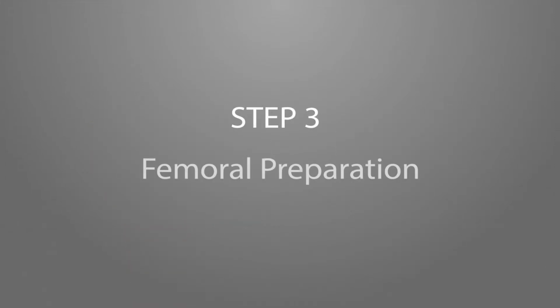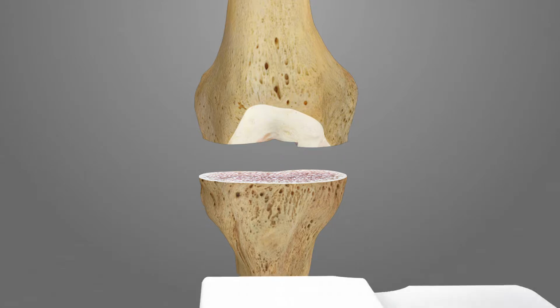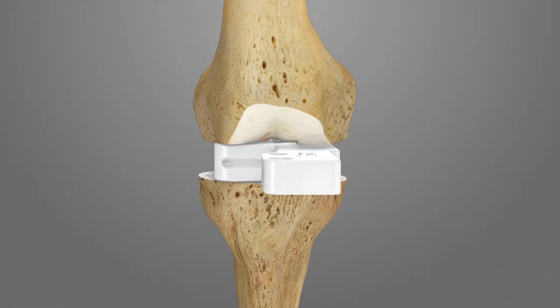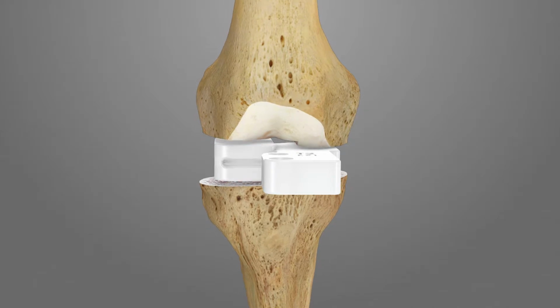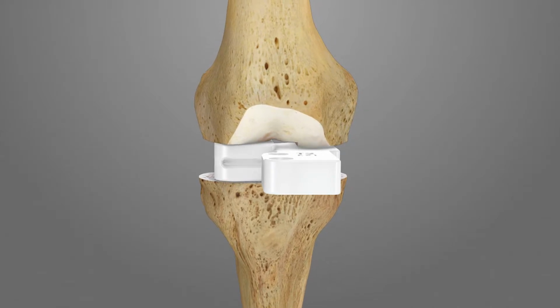Step 3. Femoral preparation. Remove all peripheral tibial and femoral osteophytes. With the knee in extension, place the extension spacer iJig T2 between the cut distal femur and the cut proximal tibia. Assess the knee for appropriate balance by applying varus and valgus stress. The joint space should be open approximately 1 to 2 mm medially and laterally.